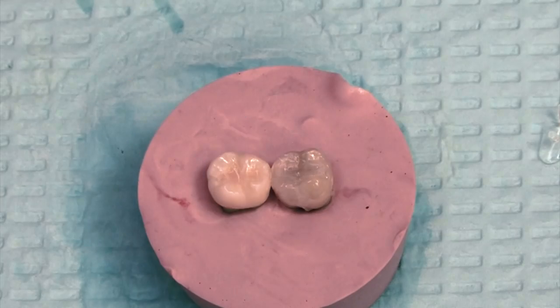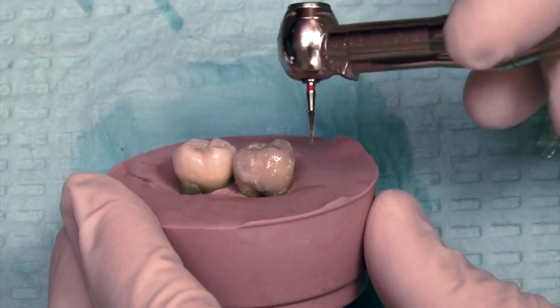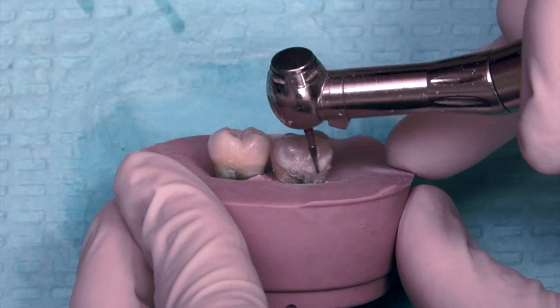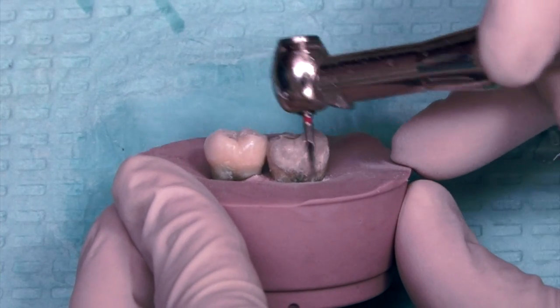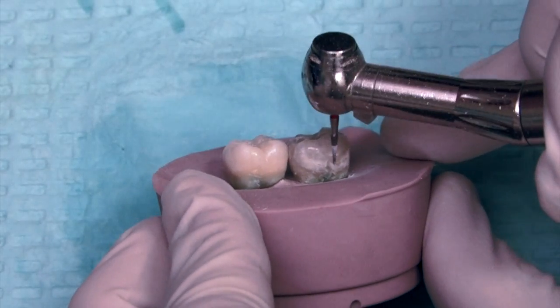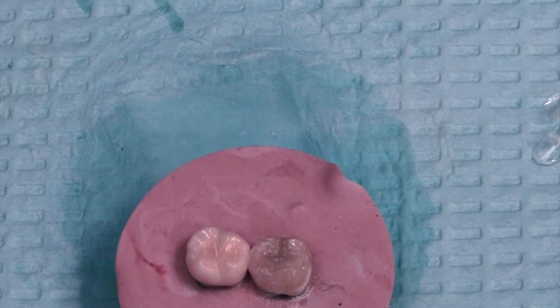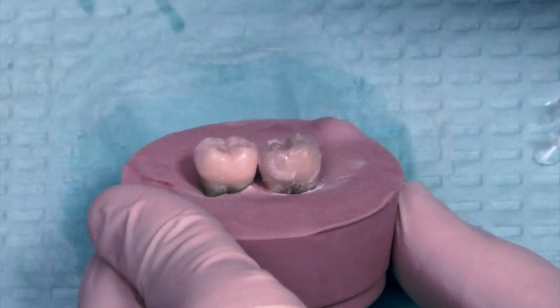The filling is in there — done in one increment. If it was a much deeper filling I may do two increments, but one is okay in this case. Flame shape finishing burr — this is a pretty quick cleanup. I always have to make sure there's nothing stuck underneath the gum line, no flash, no bonding agent. In the mouth I would take an explorer and just feel along subgingivally to make sure there's nothing extended out there that's going to be a plaque trap and cause gingival inflammation later. Just clean that up and that's it. You could take some discs or a polisher, but the fluted carbide does a pretty good job just the way it is.